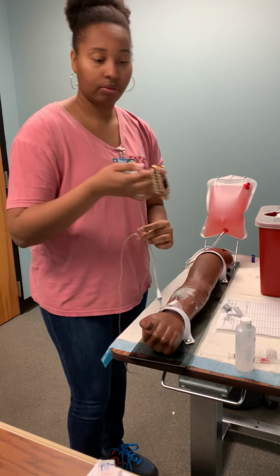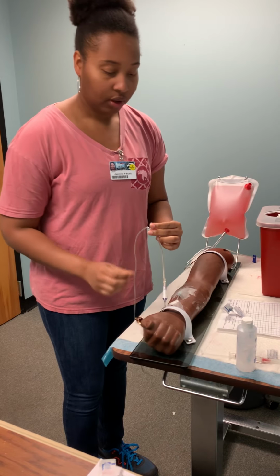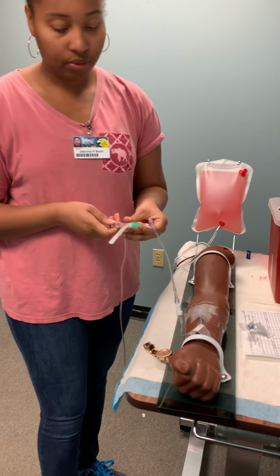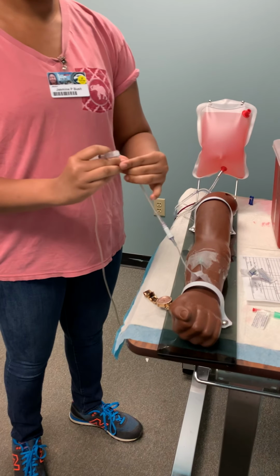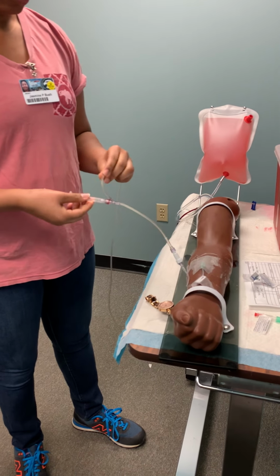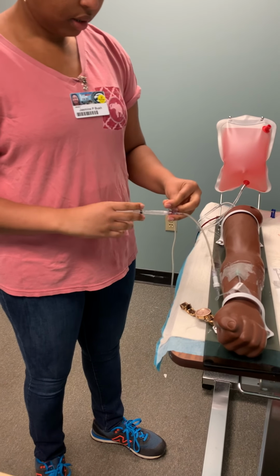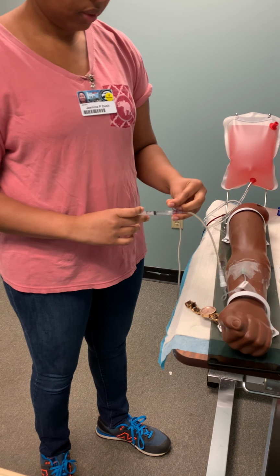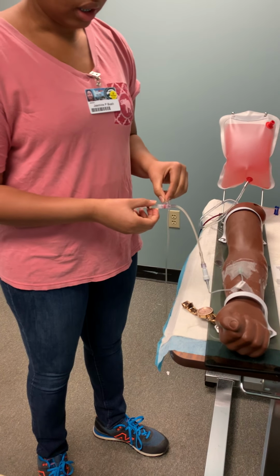The patient will be given furosemide over 1 to 2 minutes. 2 minutes because it's the safest for this patient. All right. And then I'll clamp it. And give her one. Let it go for 1 full minute.